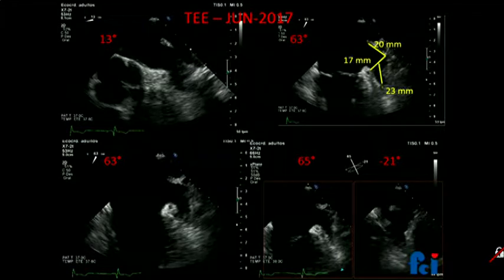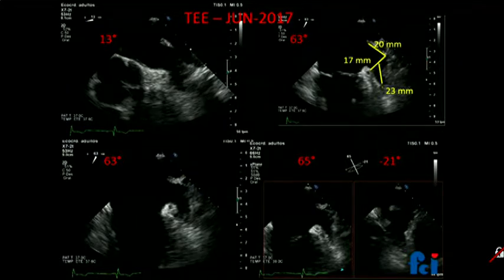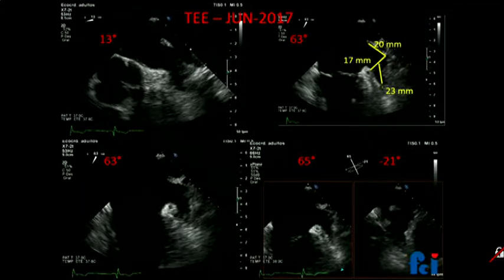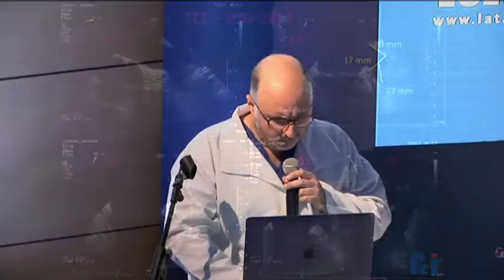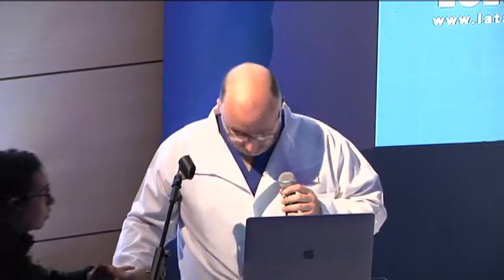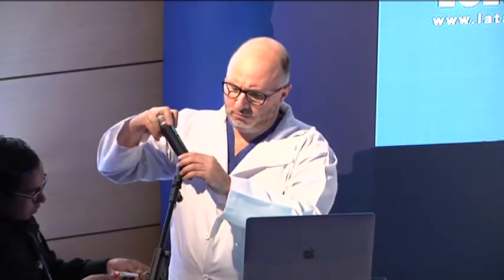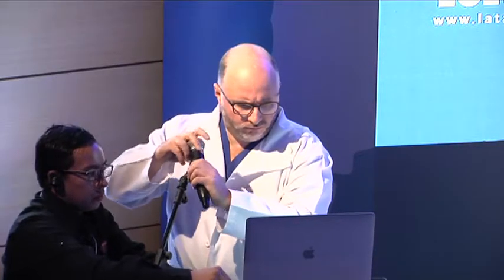Maybe you already have the intracardiac echo. We are just completing the punctures, Fermin, and are going to pass the intracardiac echo. You can go to room three and see that case, then come back. We are waiting for the transducer which is not available at this time in the room. Please move forward and I'll let you know as soon as we are ready — we would like to show you the placement of the device.